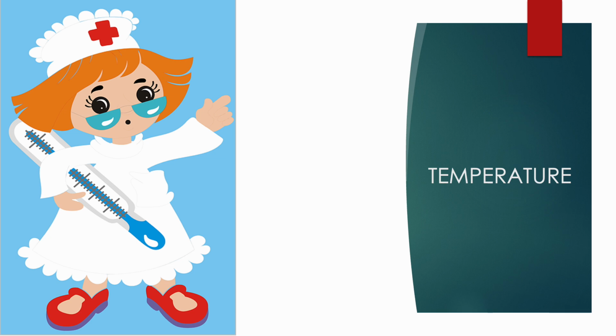Once the armpit is dry, place the thermometer securely under the patient's arm and check your second hand watch and start reading from the first minute that you come across, for a total of 3 minutes, or as instructed by the instructions on the thermometer itself. Do not remove the thermometer until the required instructed time has been achieved. Once the instructed time has been achieved, the reading that you'll find thereafter is the temperature reading for the given patient.